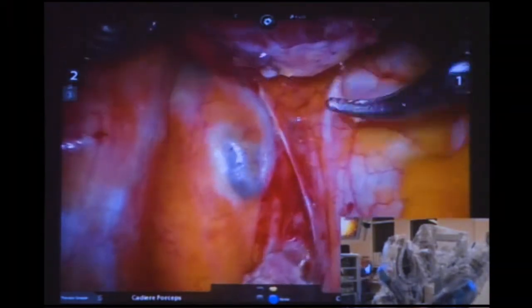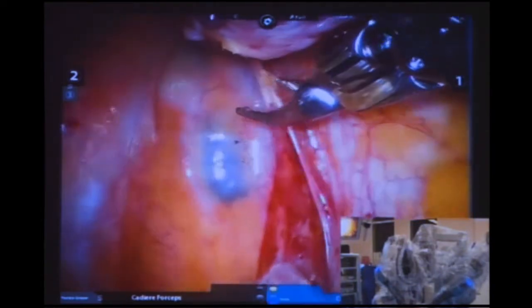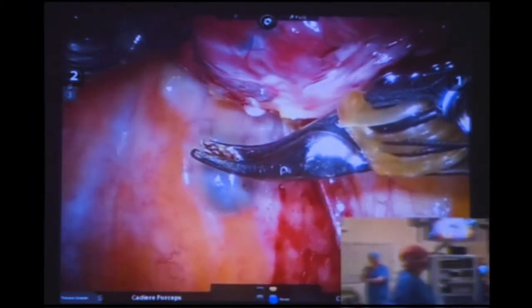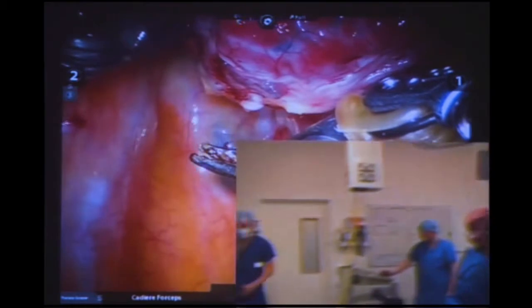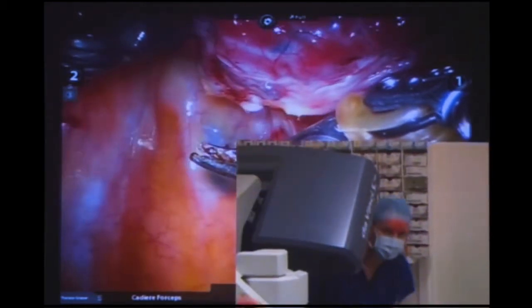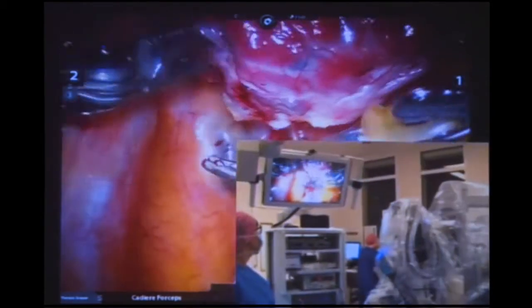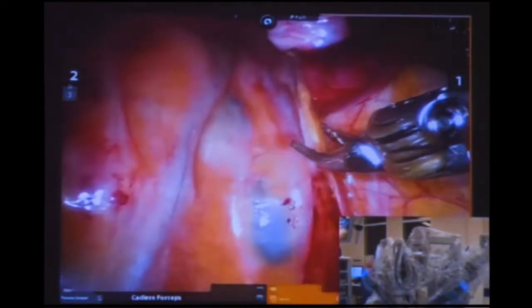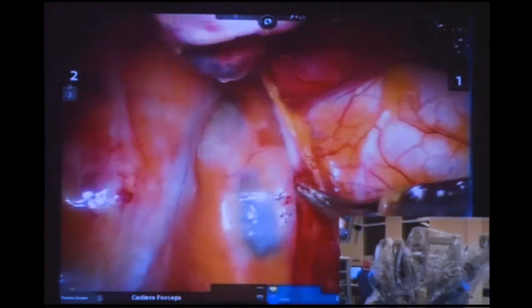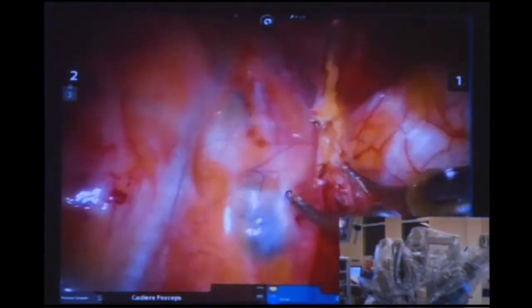I'm at the console here, and we've got Manos and Lauren and the team. The console has speakers so I can talk to them, and I can see them — so I do feel well connected. I've set up the console nice and close to the team. I also tend to keep a gown and gloves ready in the scrub room in case I ever need to get scrubbed quickly, though if we need to open, Manos is doing it while I run.